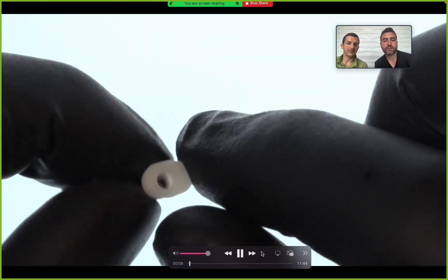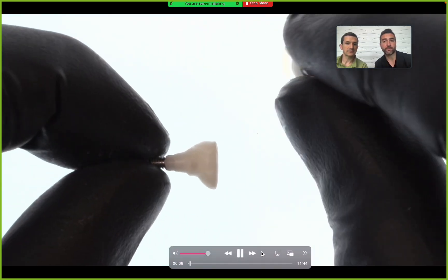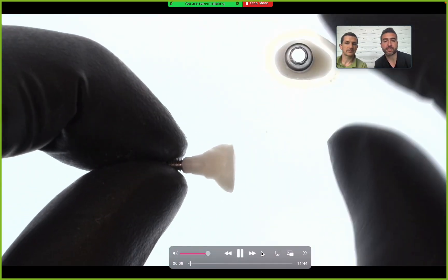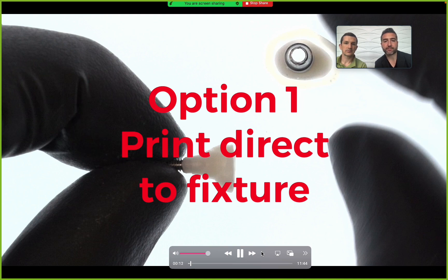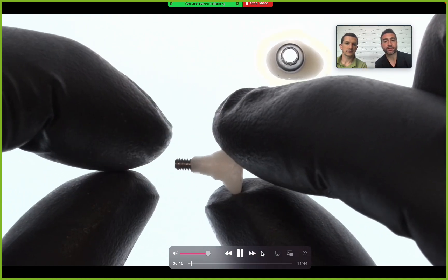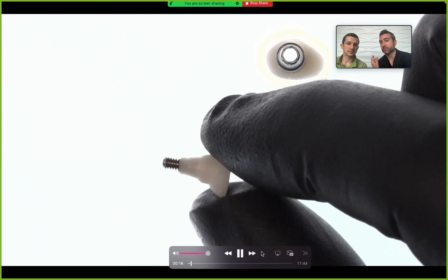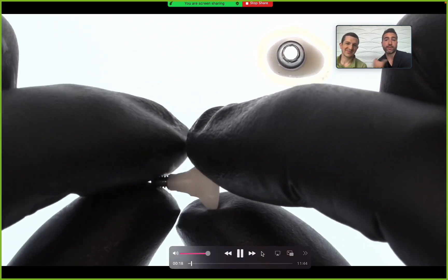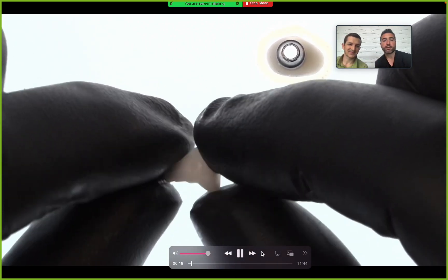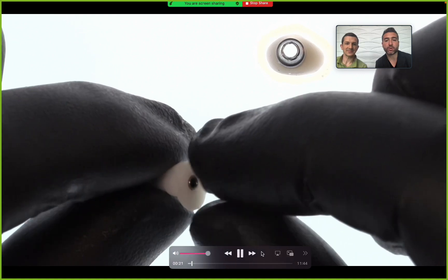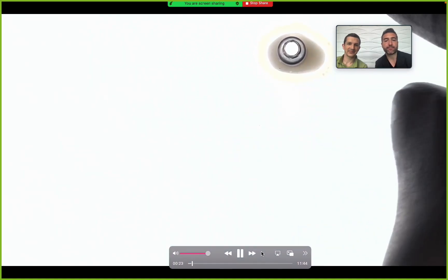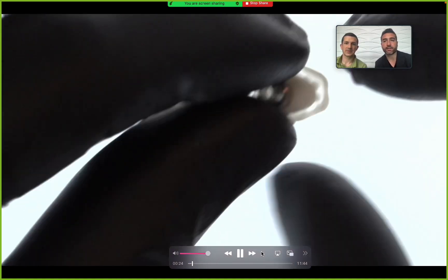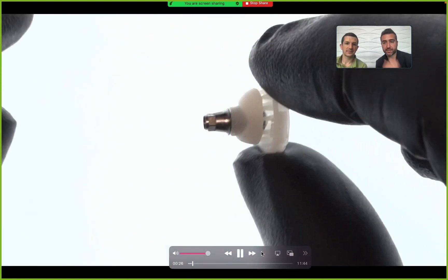The first thing we'll talk about before getting into the design is the manufacturing options. Option number one is to print direct-to-fixture. It's a little controversial. Mike doesn't like doing it that way, but I do. He's a titanium, cold steel kind of guy. I print direct-to-fixture and love it for a number of reasons.